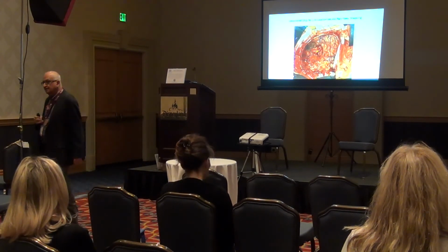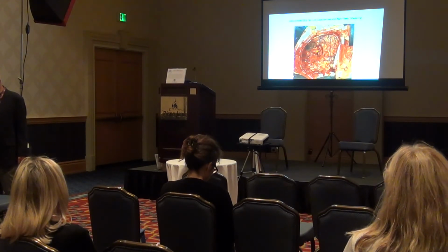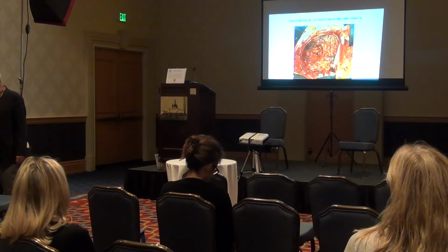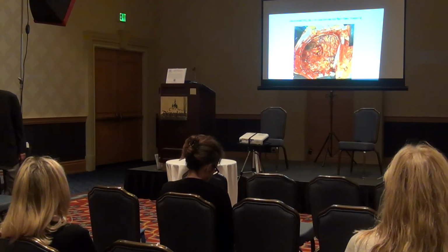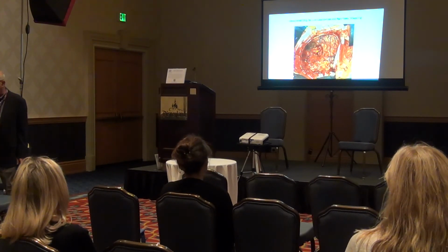Okay. Then, hope you're not too squeamish. EEGs can be done for diagnostics in a much more complicated way. When you won't just have 20 electrodes, you may have 80 to 100 electrodes all crowded in. Well, how does that happen? This is a patient of mine from Australia who was here just a couple of weeks ago.